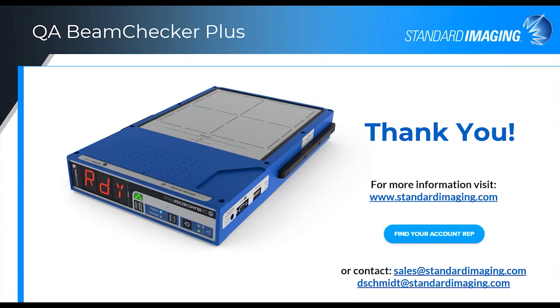The units easily charge up overnight, and typically it's within a much shorter time than that because you don't have them fully discharged. That overnight charging would be if it was nearly a dead battery. And the batteries are available. They're a standard available battery that you can buy. We do sell them, but to be honest, you'd be better off going and buying them at a local store. They're a standard format that should be very easily available.